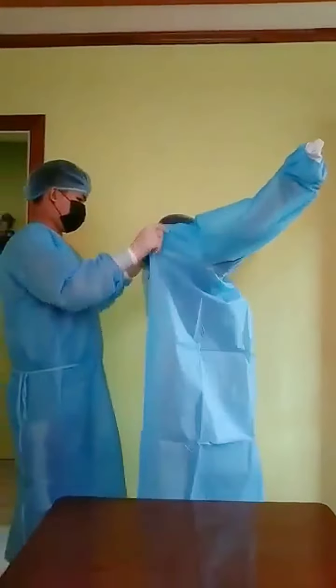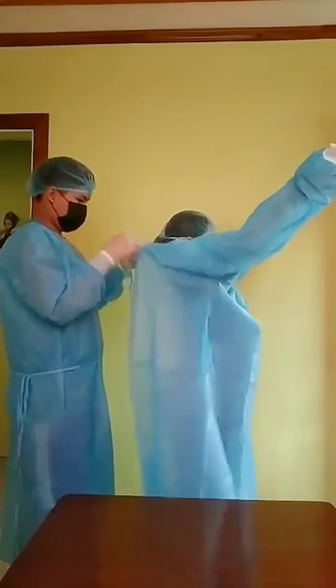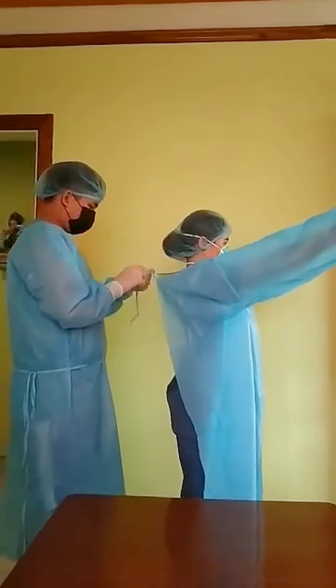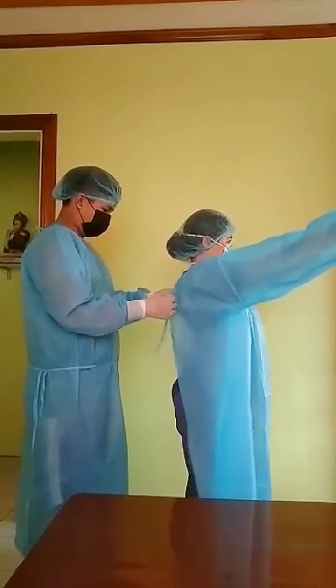The circulator will now help you adjust the gown over the scrub's shoulder, allowing you to slide your arms farther into the gown's sleeves. The neck and back ties are now tied with the help of your circulator.